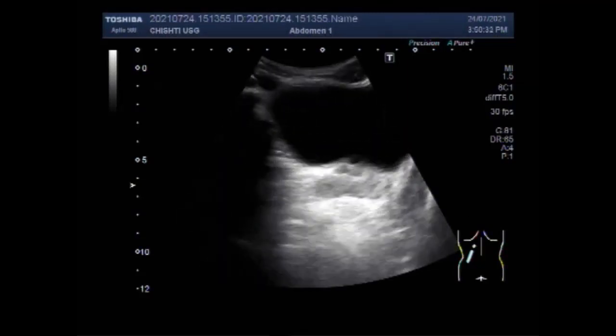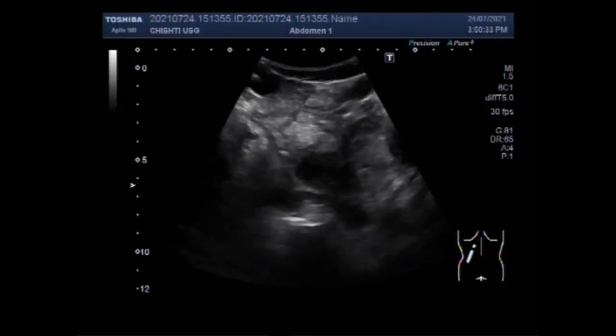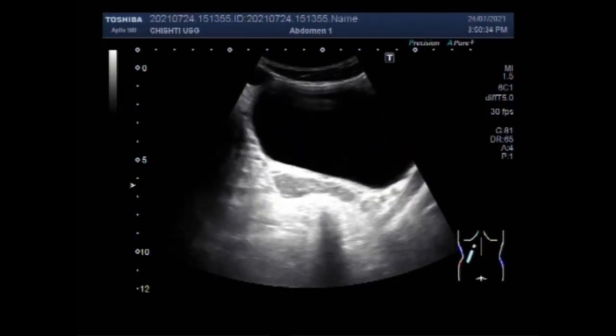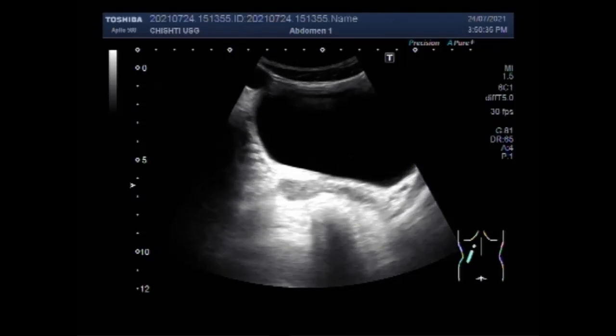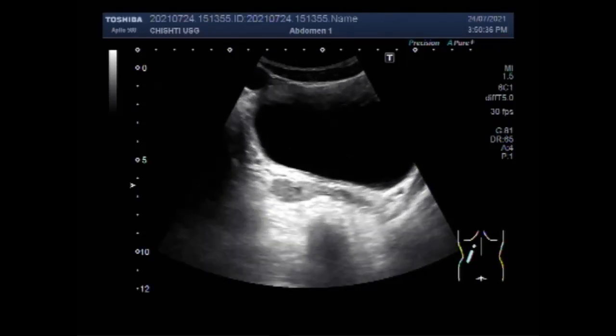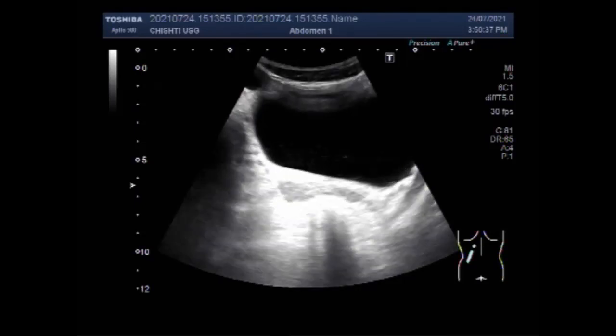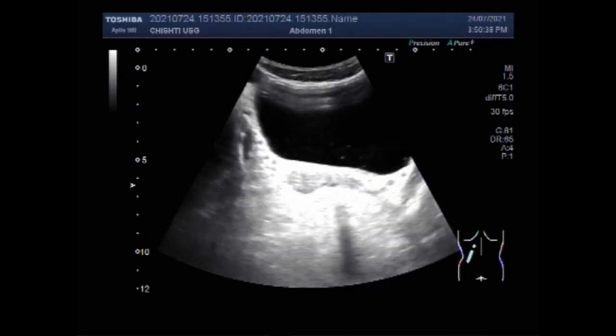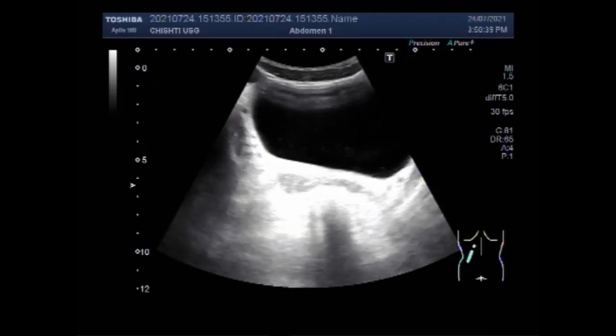Dear viewers, I hope you are all fine. This ultrasound video shows bilateral enlargement of the seminal vesicles.